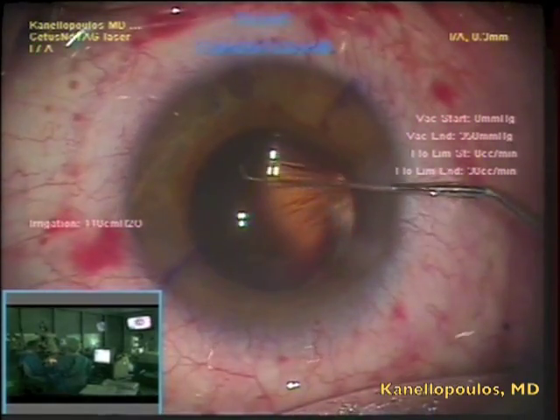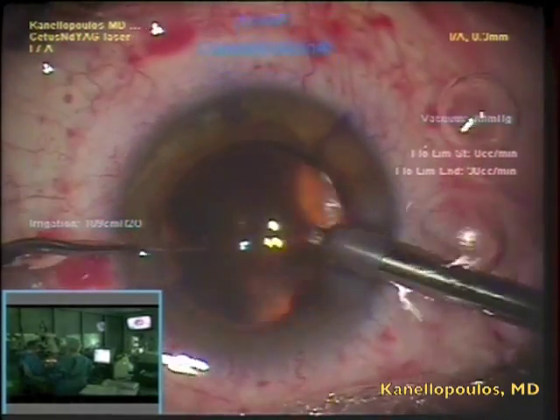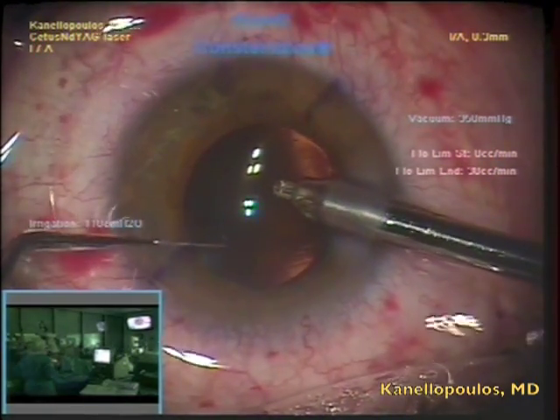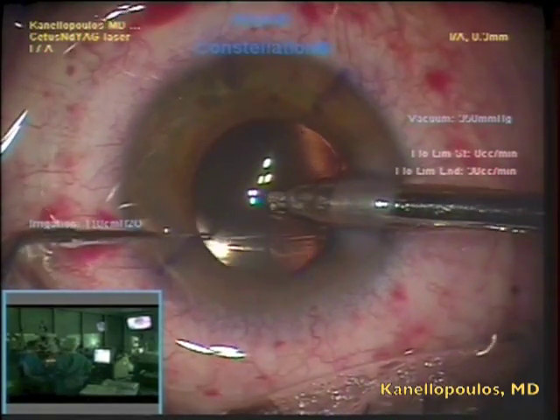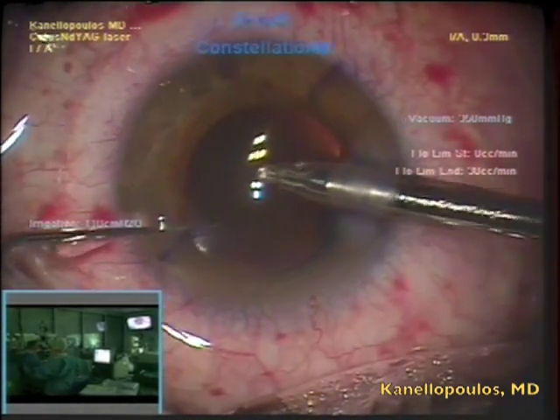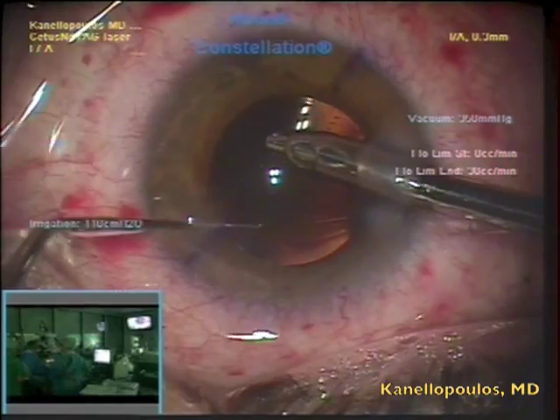All parts of this procedure are recorded and reproduced for you in real time. There is no editing of the steps we're discussing herein. The lens is positioned in place. We're going to go in and remove the final parts of viscoelastic and thus complete this procedure. I hope you found this material interesting. This is probably the first time you're being familiarized with an all-laser cataract procedure — the LensX Alcon femtosecond laser used to avoid the use of blades, incisional capsulorrhexis, and lens fragmentation, and then the CETUS nanosecond laser used as the means to emulsify and remove the pre-dissected pieces of the cataract prepared with the femtosecond laser.